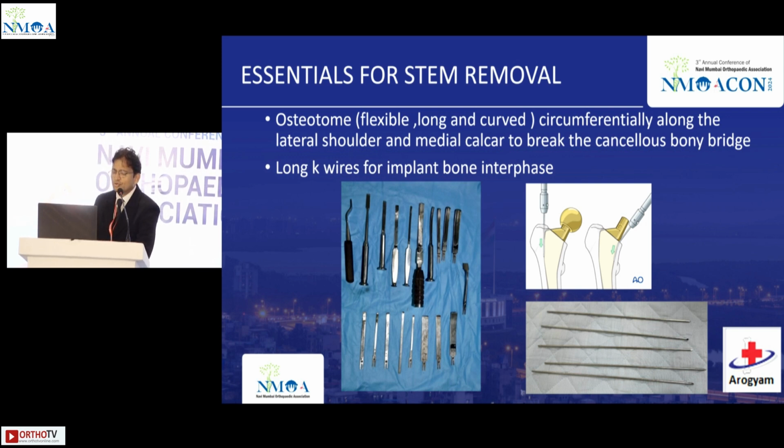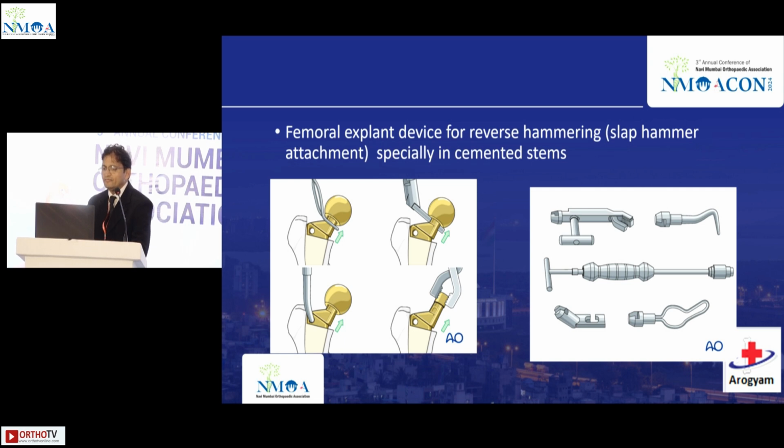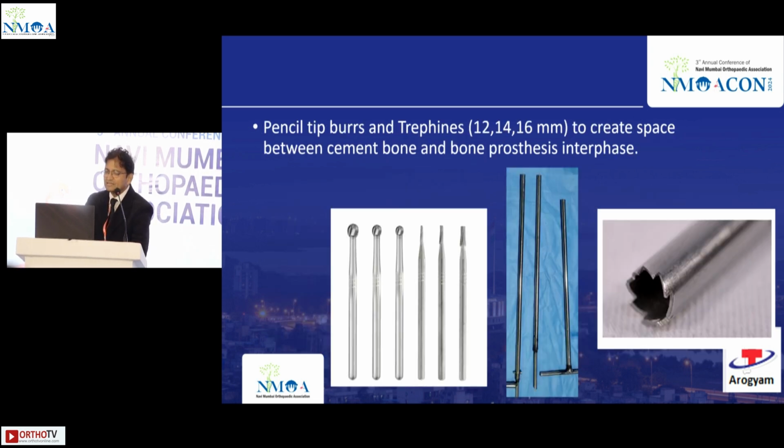We require osteotomes, flexible, long, curved, in various designs. Long K-wires are required. Then we need to have a Gigli saw as well. We need to have the femoral explant device. We need to have burrs with us in all shapes. Trephines are very important to remove a broken stem.